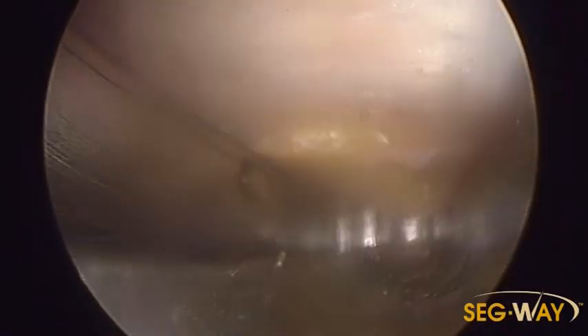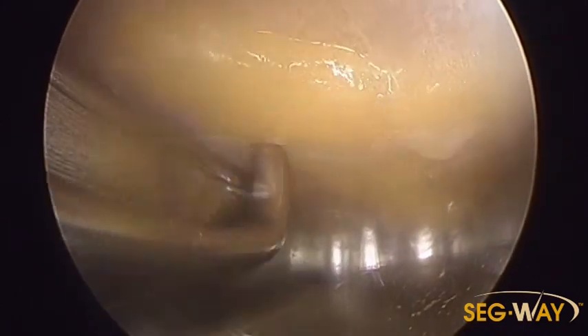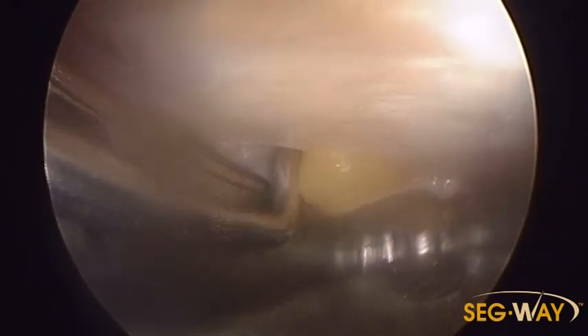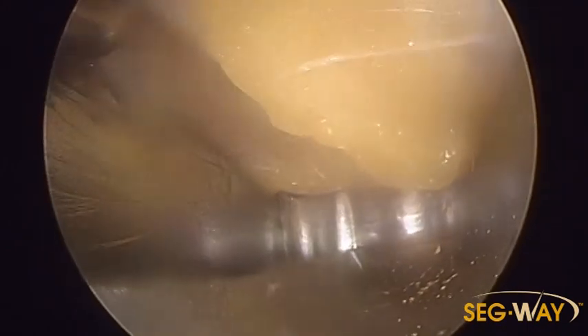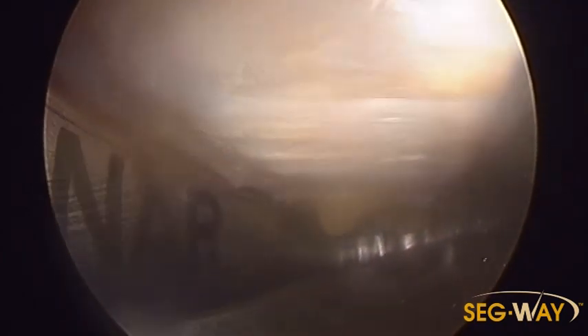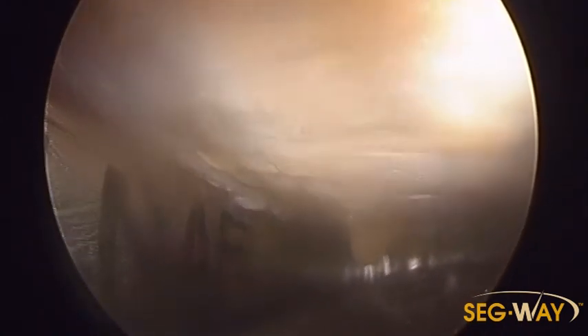You can use the probe to clean some of the tissue off the ligament, finding the edge. Right here is your edge where the fat's protruding — there is the edge of the ligament. You can see the fibers right there of the ligament. It's all cleaned off with the rasp.